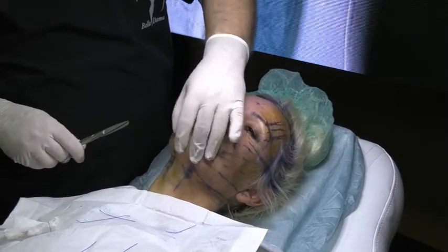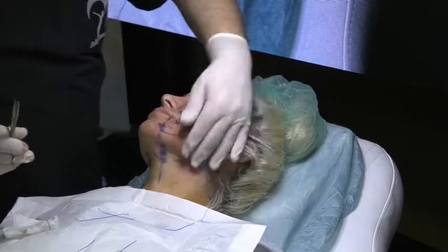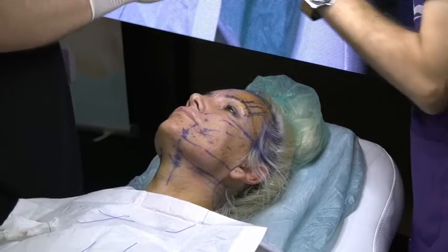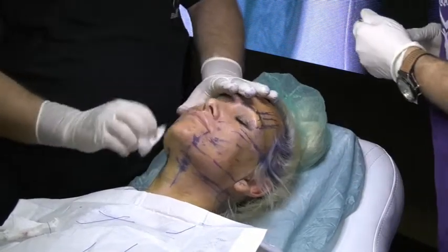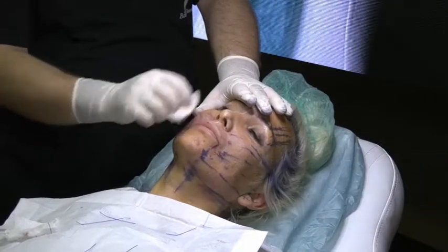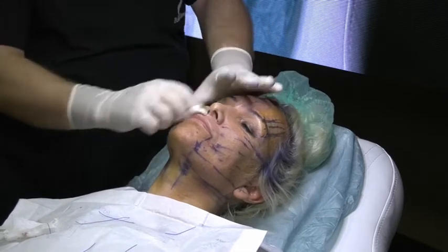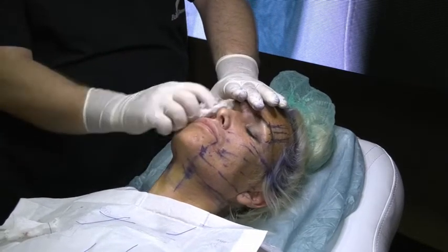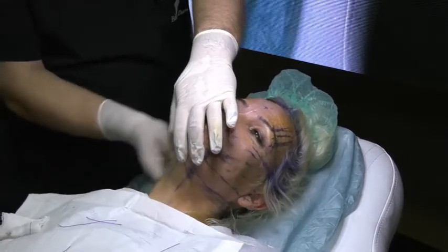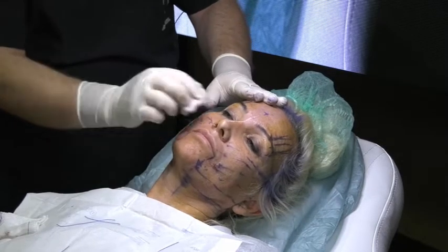Dr. Abdo, I want to clean this alcohol, if you don't mind. I'm just cleaning softly, support your skin. I just want to clean to show you some findings.